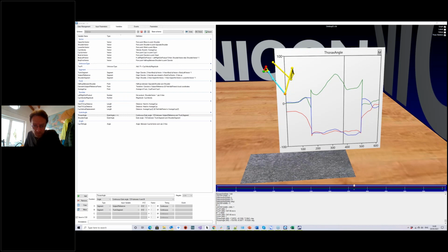I've noticed the body language code and ProCalc calculate coordinate system definitions differently. ProCalc seems to follow the right-hand rule while bodybuilder does not. That is news to me. For sure, ProCalc follows the right-hand rule, as it should. I was not aware that bodybuilder does not.